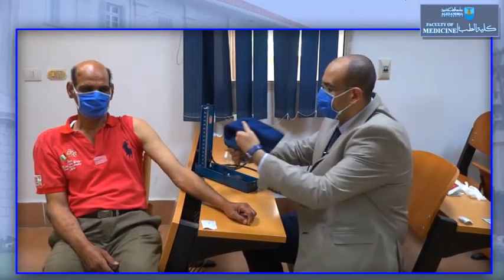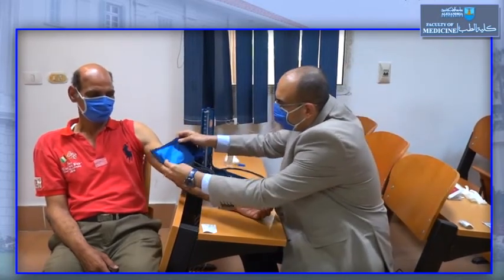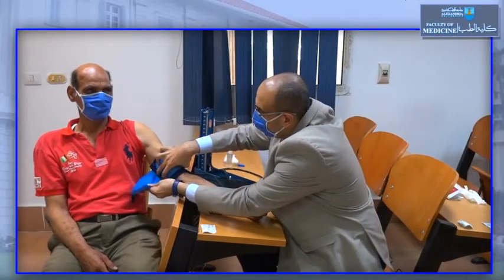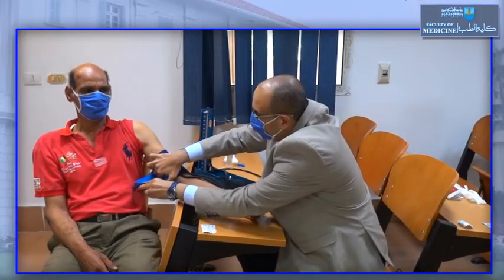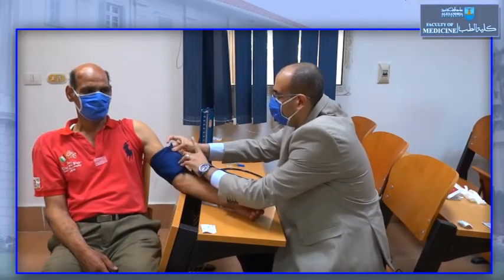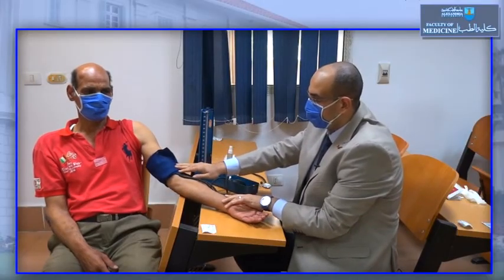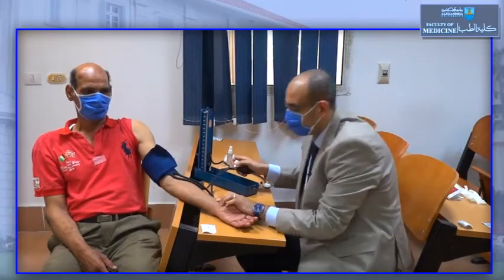And then we put the inflatable cuff. This is the proper position. And we should wrap it tightly, but not very tight. And the tubes should be medial, at the middle of the cubital fossa. At first, we measure by the palpatory method.